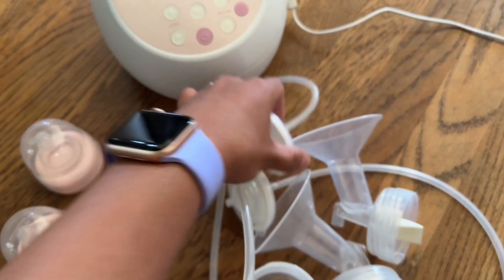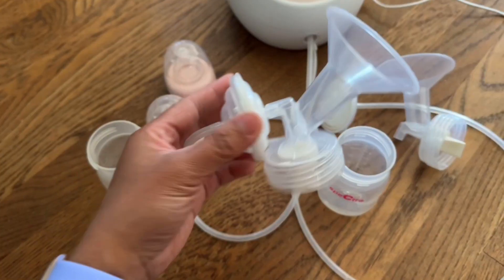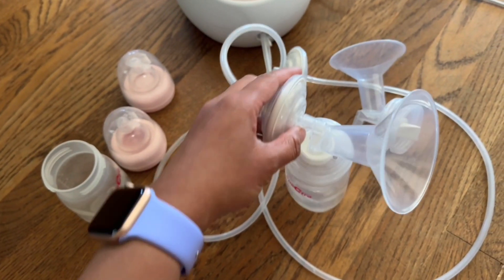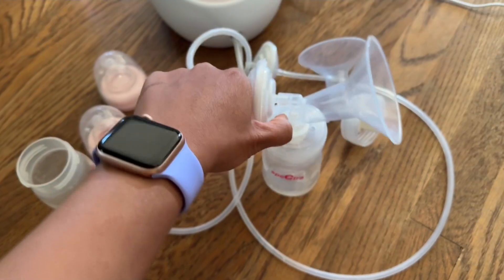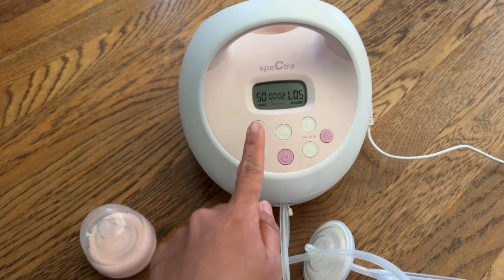You've got your tubes right here. This connects to your flanges, so it goes like this, and then you put the bottle, and then you put it at your breast. You do the same for the other side.